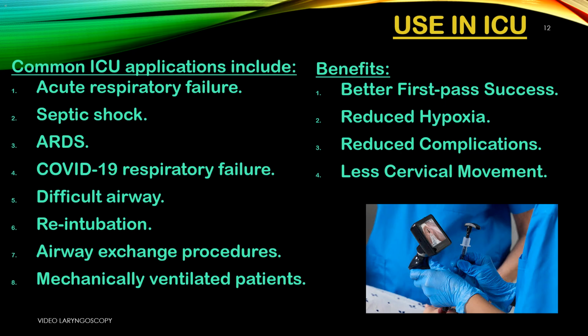Use in ICU. Common ICU applications include 1. Acute respiratory failure. Urgent intubation needed. VL gives a better view when time is critical. 2. Septic shock. Patients are unstable. Faster, successful intubation reduces the risk of crash airway.